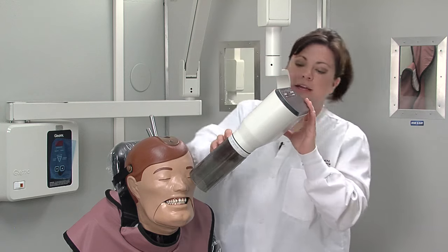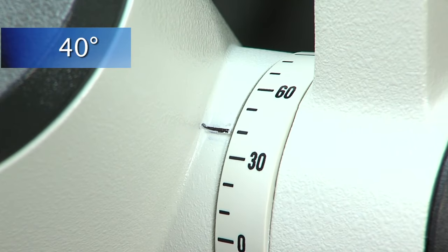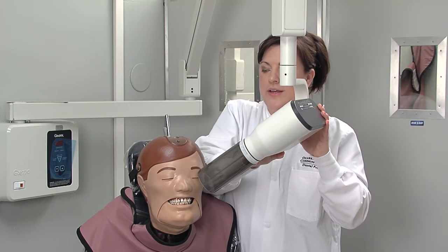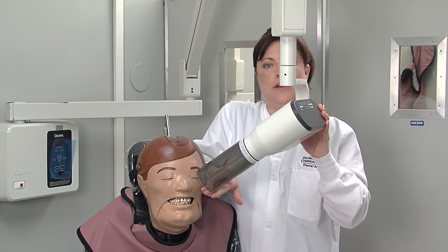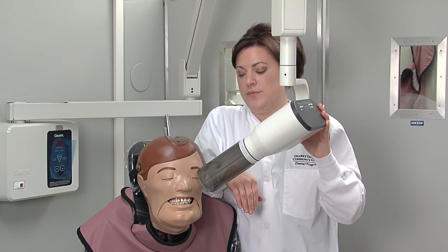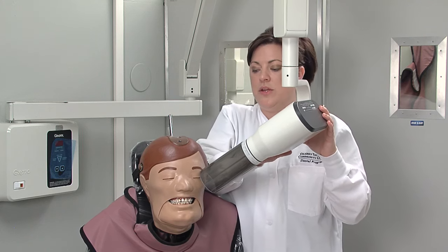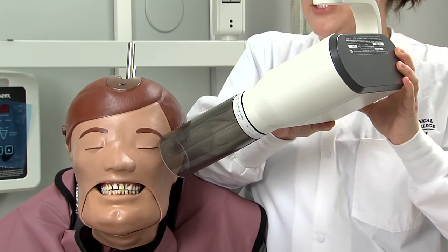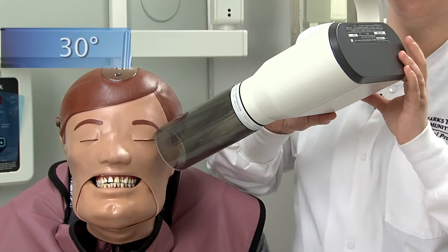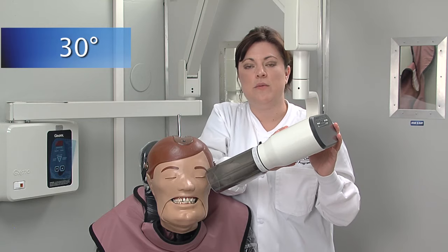Whenever we move back to the maxillary premolar exposure, we're going to change our angulation slightly to approximately 40 degrees, and center our PID around the anterior portion of the cheekbone — this will differ depending on your patient's anatomical landmarks. For the maxillary molar exposure, we're simply going to rotate it around to the back of the cheekbone, the zygomatic arch, and decrease our angle slightly to approximately 30 degrees. That is all the PID positioning for the maxillary arch.